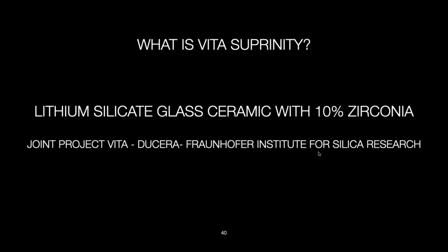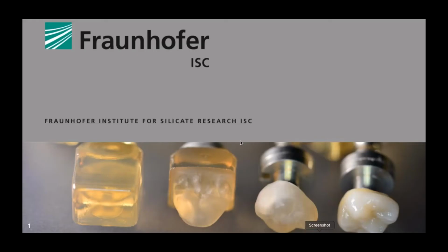So what is Suprinity? Suprinity is lithium silicate glass with 10% zirconia reinforcement. And it's basically a joint project between the Fraunhofer Institute, I don't know if I pronounced that right, Ducera and VITA. And so these people are government people, and then they help business people develop products. So they've got millions of these Fraunhofer Institutes. They got them for everything you can imagine.